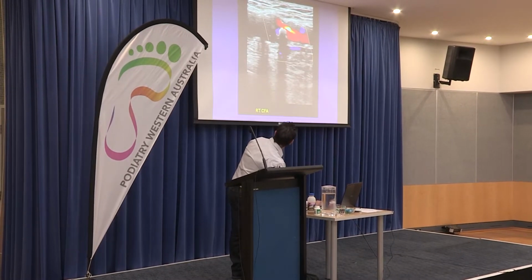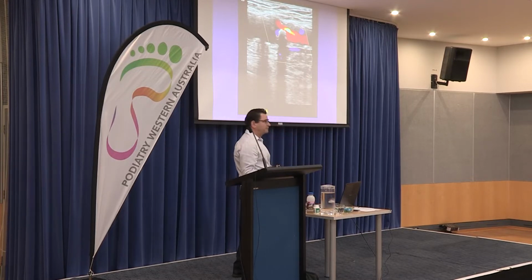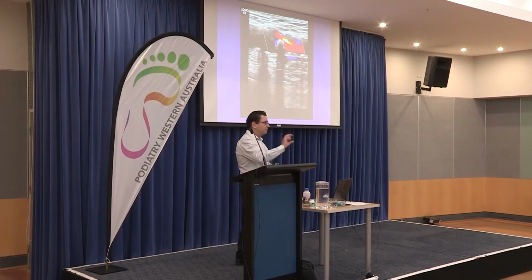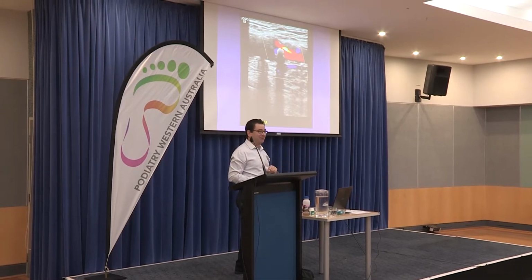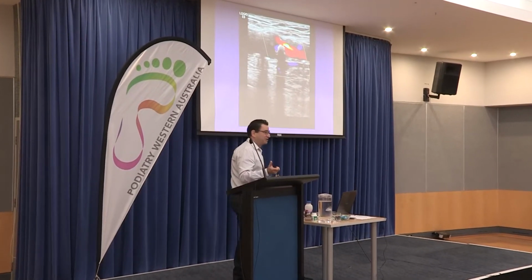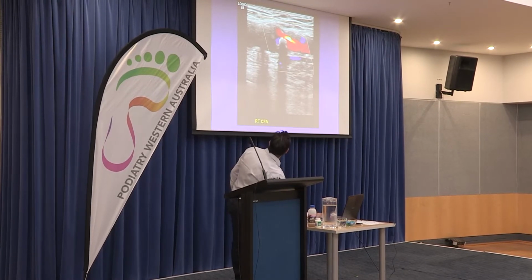Fair enough. So this is an arterial example. I was talking before. So this is the vessel here. We code flow towards as red and flow away as blue, but you can flip it if you know what I mean. So we make arteries look red and veins look blue because that's what's flowing in the middle of them. But just be aware that's just flow direction, and you can just flip the switch. You can make an artery blue and you can make a vein red if you want. But by convention, we like to make arteries look red.